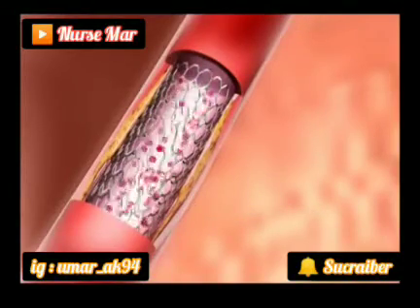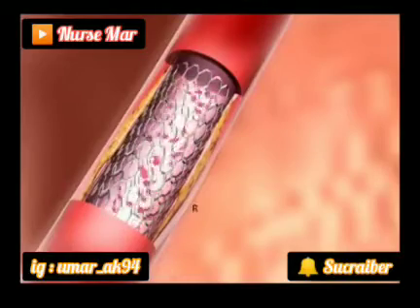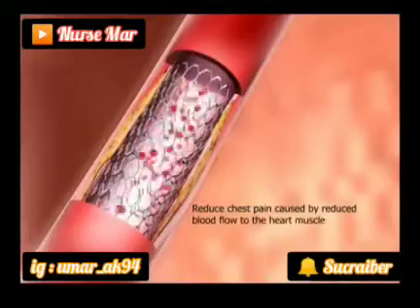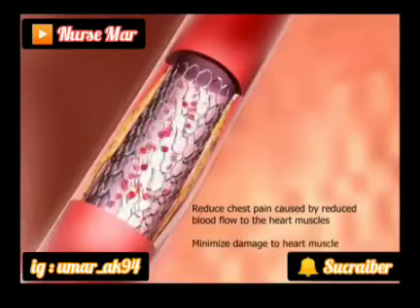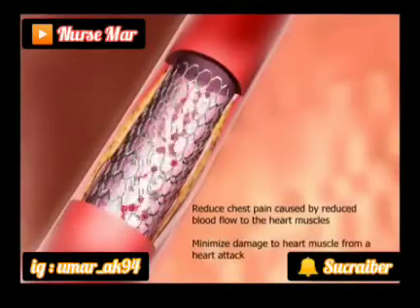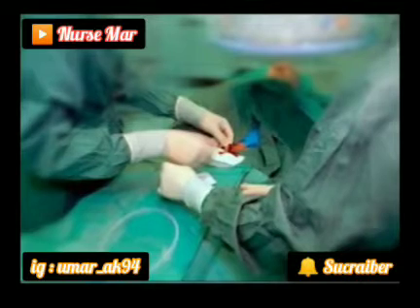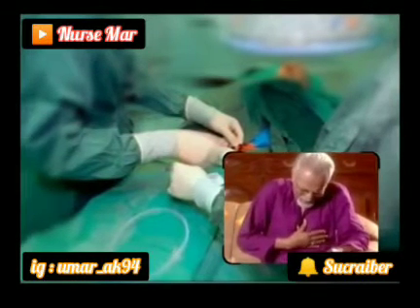Coronary angioplasty may be needed to reduce chest pain caused by reduced blood flow to the heart's muscles, and to minimize damage to heart muscle from a heart attack. This procedure is sometimes done as an emergency procedure after an angina or heart attack.